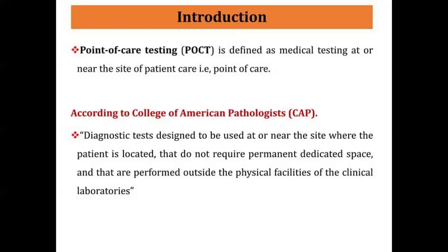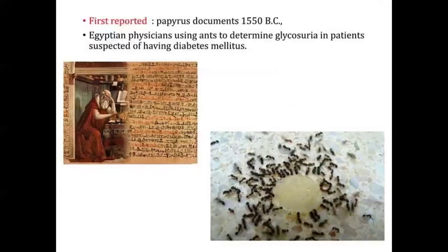You can always carry it along, and these devices are usually small so that you can carry them wherever you want. These are diagnosis based, mainly designed so that wherever the patient is located, you can analyze directly rather than calling the patient to a particular physical facility.